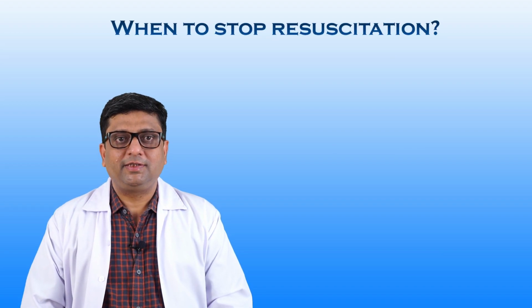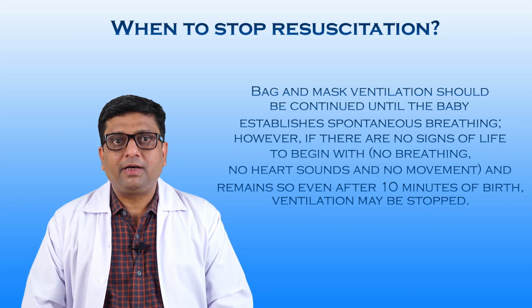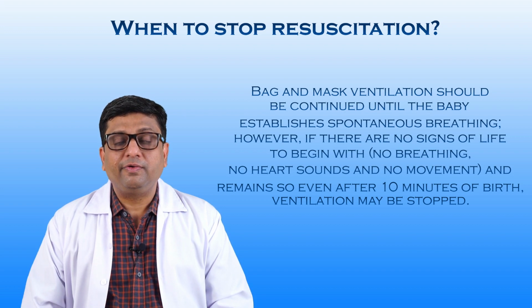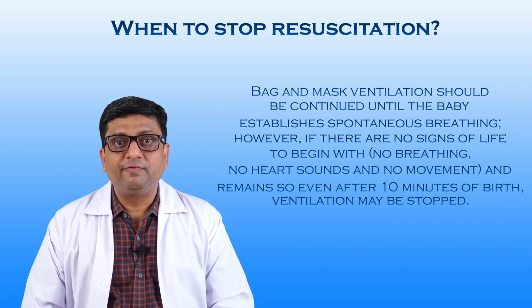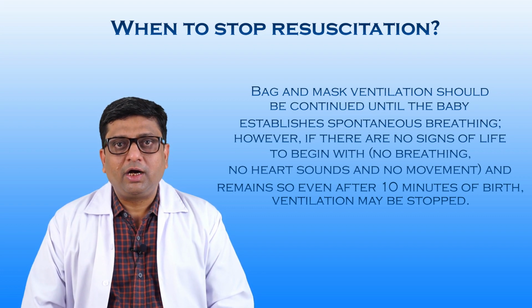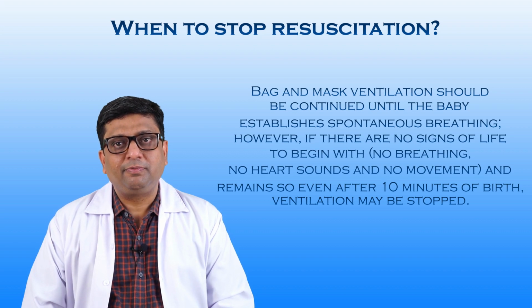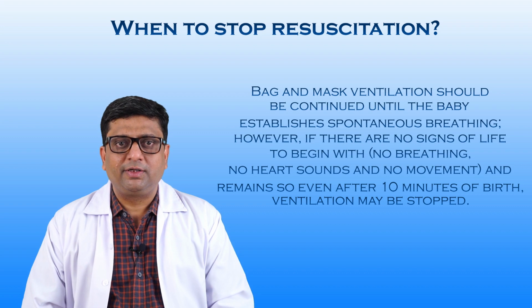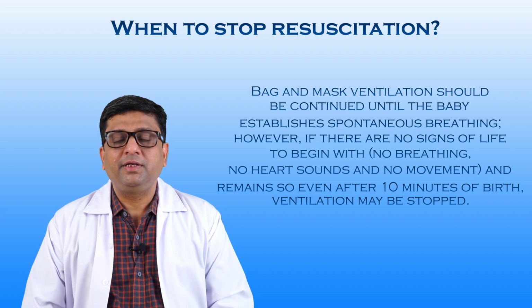When to stop resuscitation? Bag and mask ventilation should be continued until the baby establishes spontaneous breathing. However, if there are no signs of life to begin with, that is, no breathing, no heart sounds, and no movements at birth, and they remain so even after 10 minutes of birth, ventilation may be stopped.